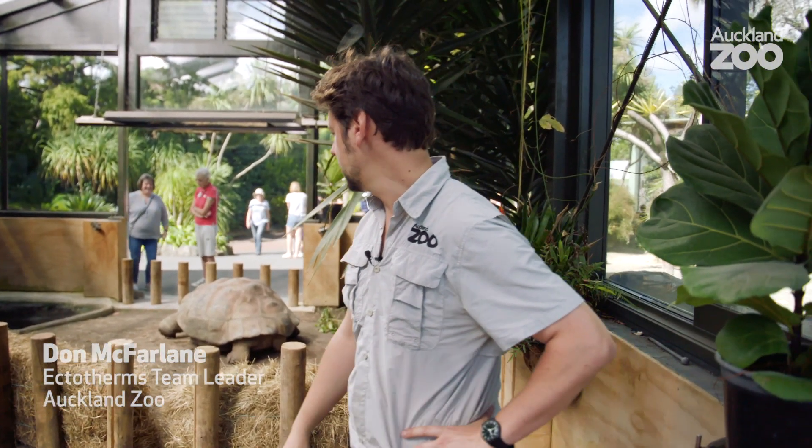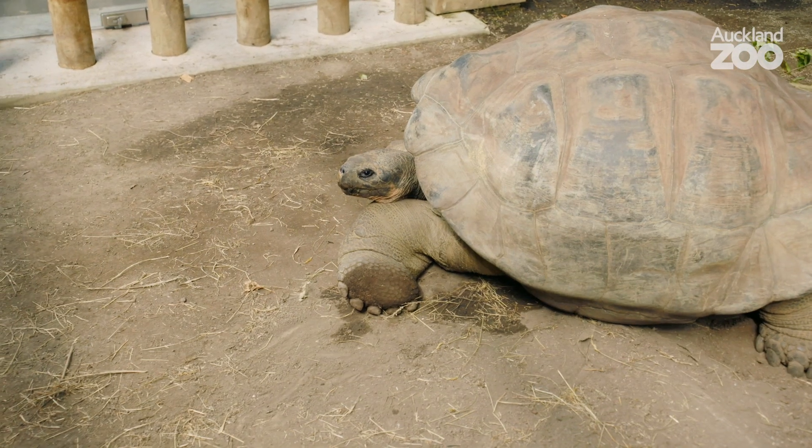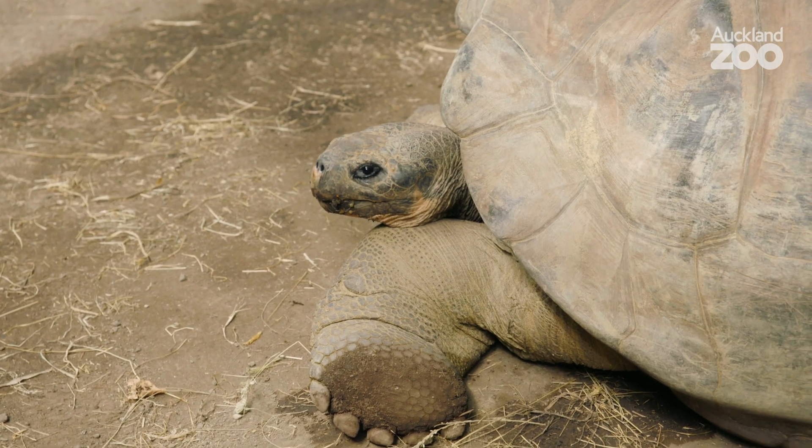In the background here is Willie, our male Galapagos tortoise, only 47 years young. A couple of weeks ago one of our keepers noticed that he was a bit lame on his front left leg. He was limping a bit and that didn't go away — it continued for several days — and so of course we had to get the vets in.